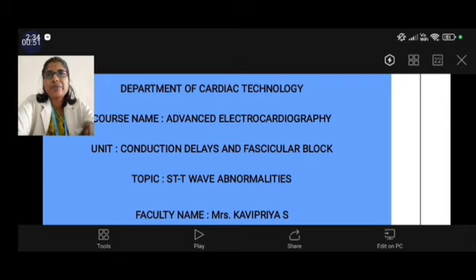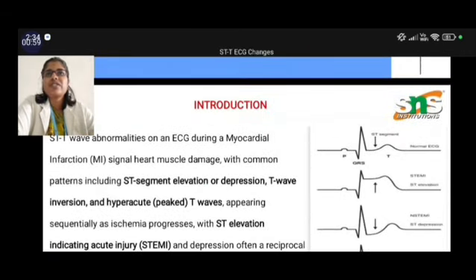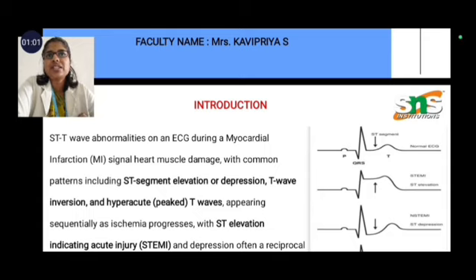Now the case presentation is about myocardial infarction. The topic is about ST segment changes and abnormalities. Here the patient is suffering from mild breathlessness for 1 day, extreme pain in the chest region for 1 day, and giddiness also. The patient is male, his age is about 54 years old, and he is suffering from breathlessness and giddiness also.